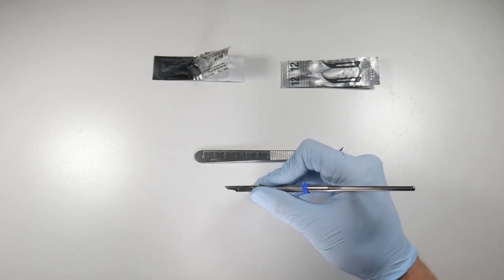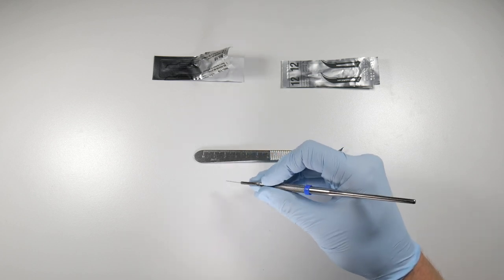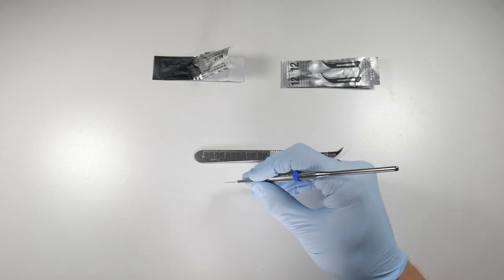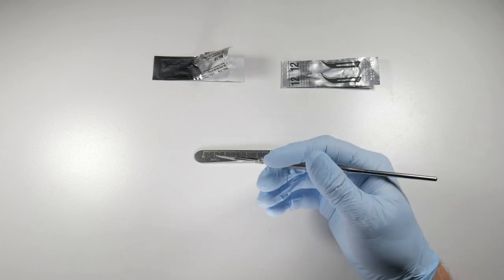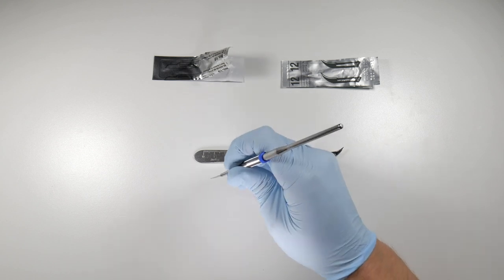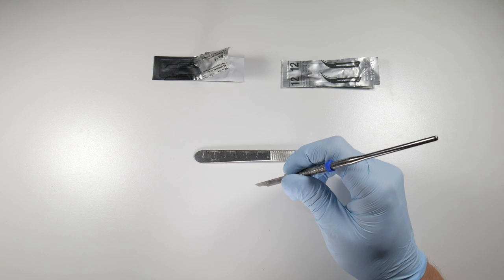As you're pulling the scalpel along, you want to press very, very firmly. If you don't, what's going to happen is you're going to cut and you're going to end up with a partial thickness flap because you're not going to get through that periosteum all the way to the bone.